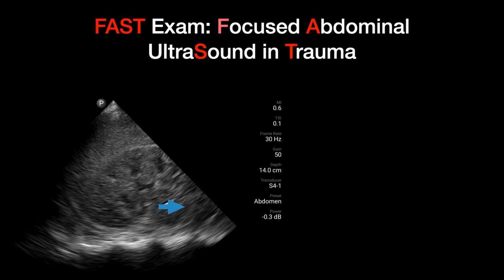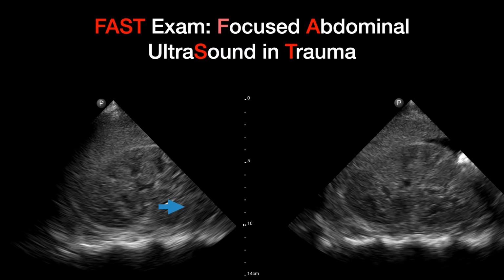Now, you need to be careful when you do these studies. You can easily mistake that you didn't get an adequate view of the kidney, and you need to look down to the inferior pole, because the most sensitive place to see the fluid is actually near the caudal tip of the liver, in between the kidney and the liver. There is seen in the picture towards the right.